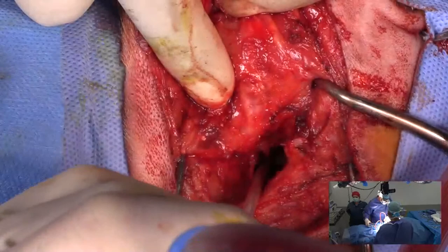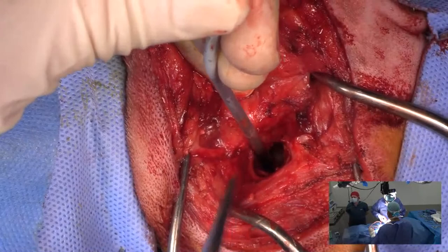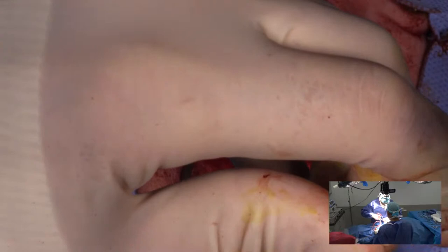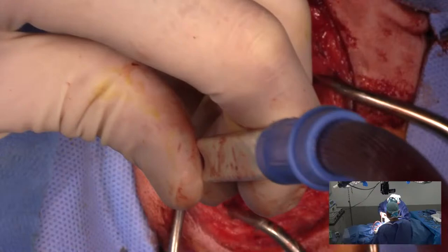Now I'm really going to take my time here to try to identify any more secretory material, remembering that we have to avoid the dorsal region because that's where the vestibular apparatus is. And if you damage the vestibular apparatus with this surgery, these guys are just miserable for a long time, and they'll have a head tilt for the rest of their lives. So every time they come in to see you, you're going to be reminded of how you damaged that vestibular apparatus. So I'm just really, really careful to avoid going dorsally once I get inside the bulla.